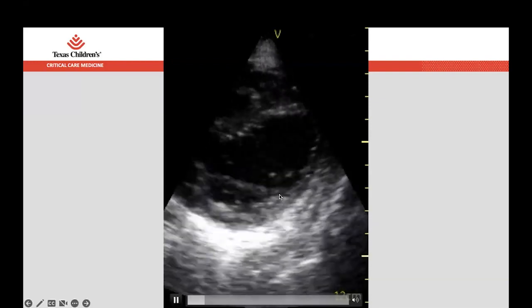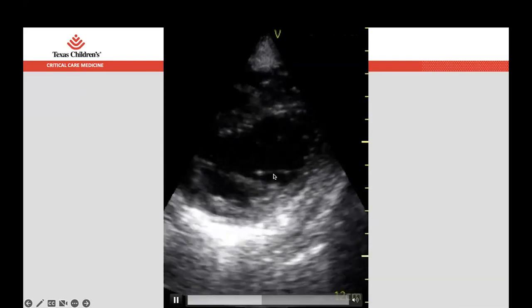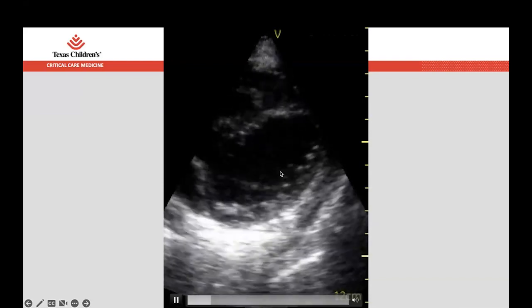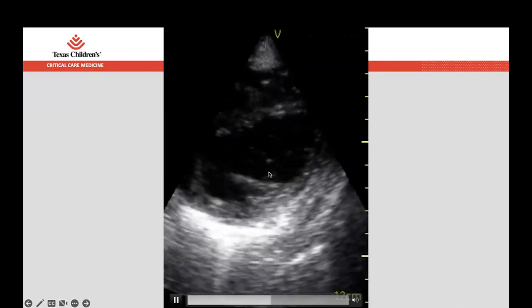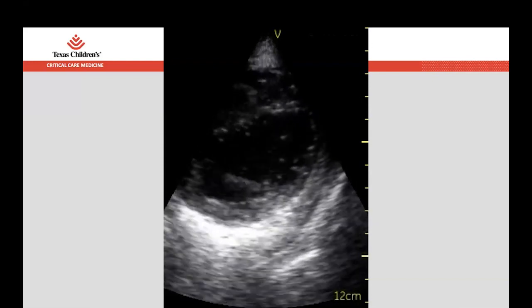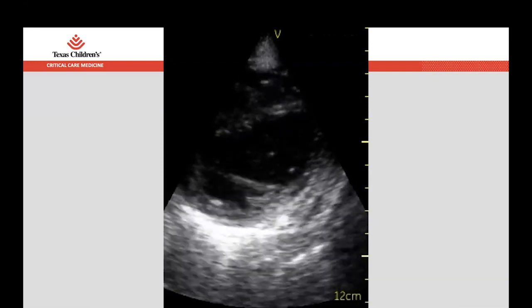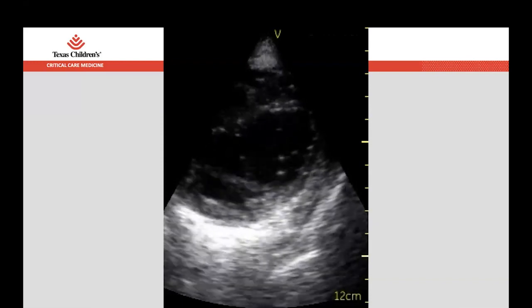You can see less and less squeeze. We can see now the spontaneous contrast, those fireflies, on the left side of the heart. And the difference is, when you're seeing it on the left side versus the right side, this probably isn't a bolus, right? And so this is blood that's just not moving very well. We can still see the heart squeezing, and we see some spontaneous contrast.